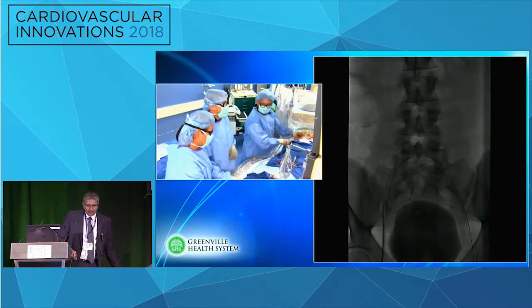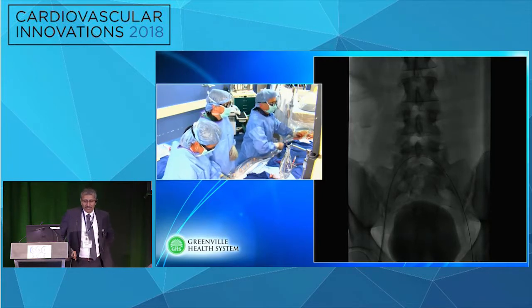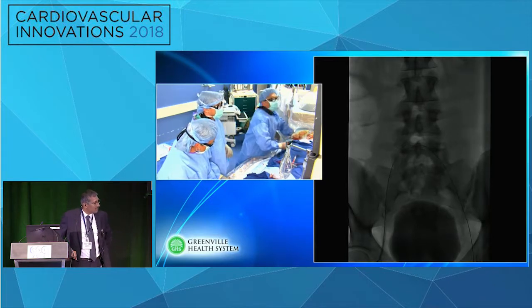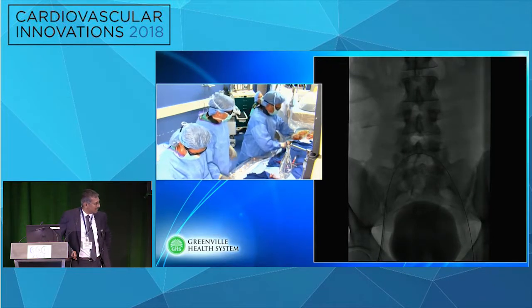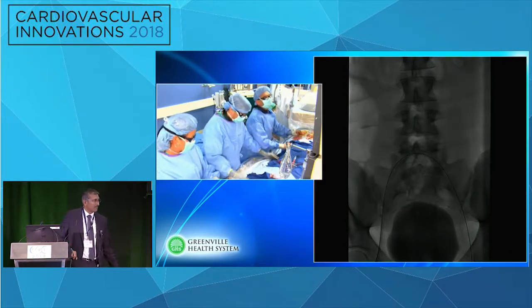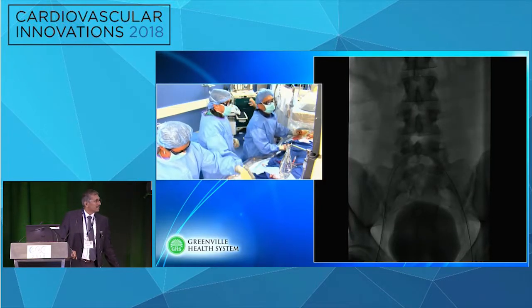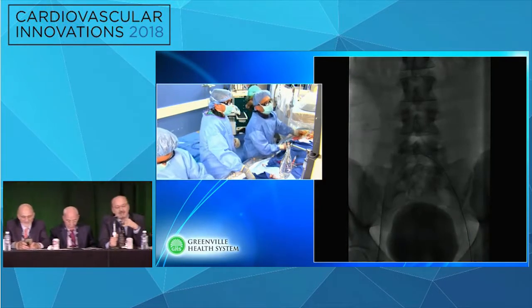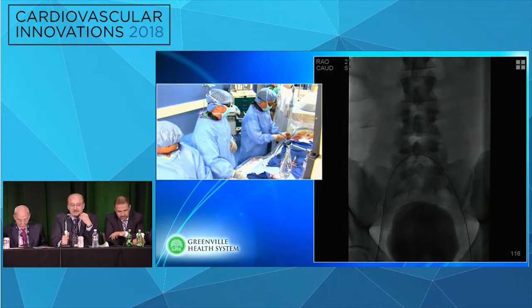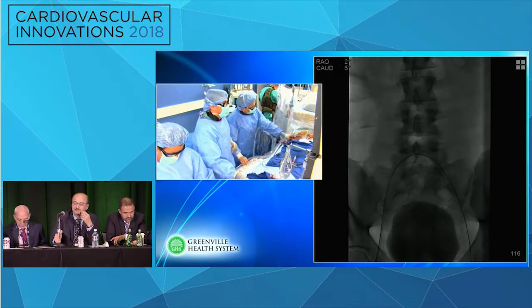I think we all agree. We just have questions regarding the placement. We do agree on 12 or 14, but we will be very interested to see where you actually land it distally. Munir believes you may have to go further down. I personally believe, and we'll ask the panel, that you could land it in the common femoral, the part we visualize on the angio. If you land it first in the common femoral and you still have a lot of collaterals, you know there's a problem there. I see. And I now agree with that, you will go to the profunda better.